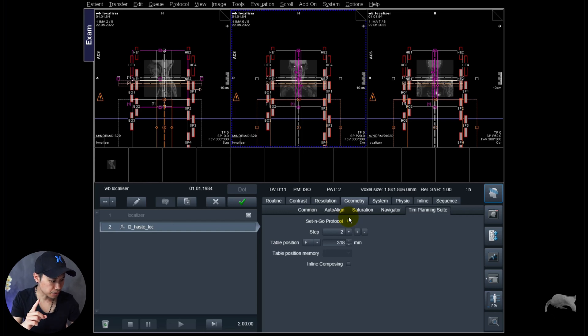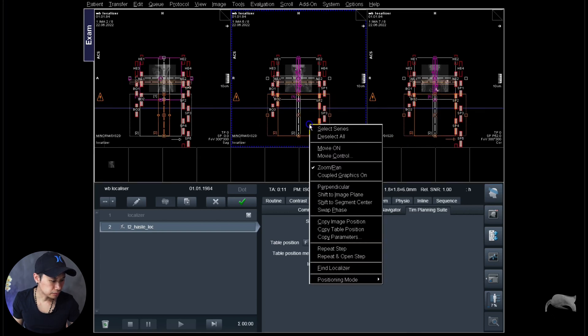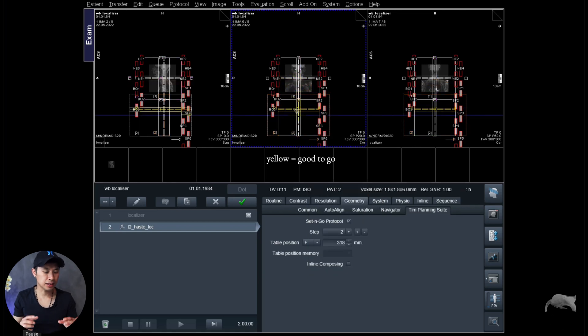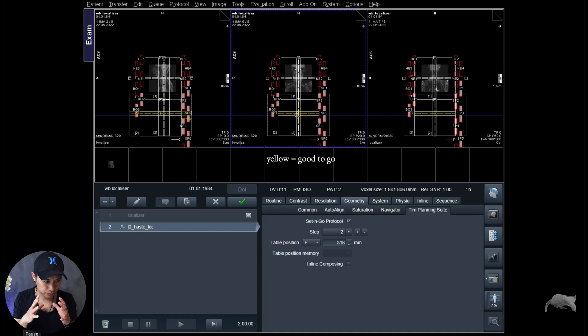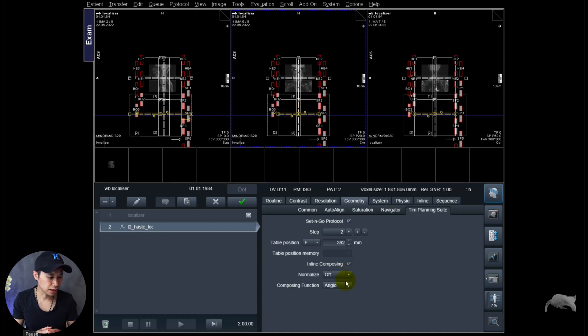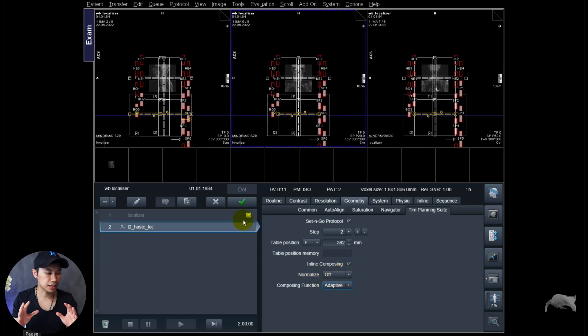It's okay like that but we have to do one adjustment to make it yellow. You can see the transversal right up in there, we're going to drag it down so it will fit in that specific field of view. So that's yellow, it will work. And we put on the inline composing so it will automatically compose first whenever the sequence is finished.